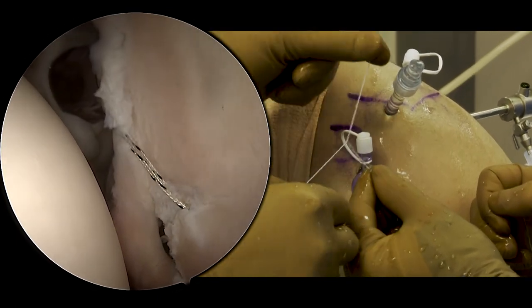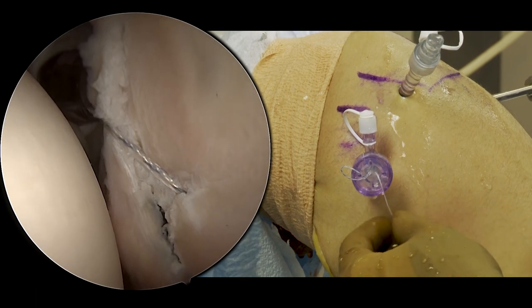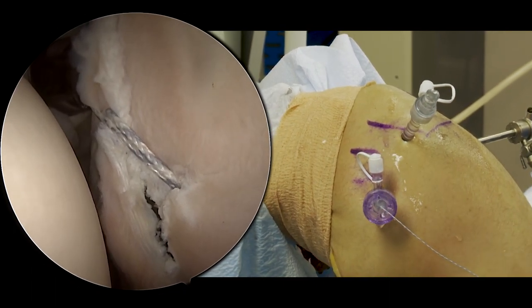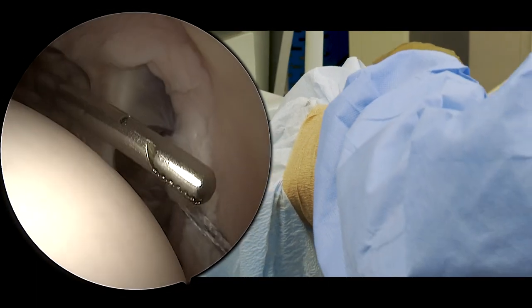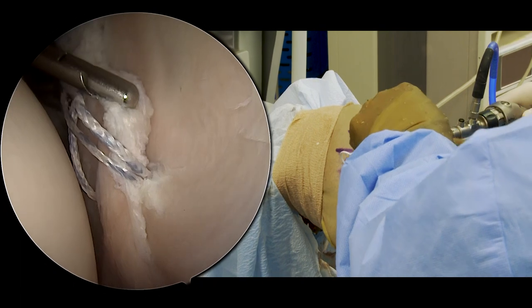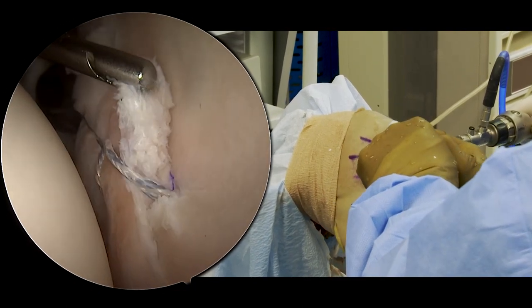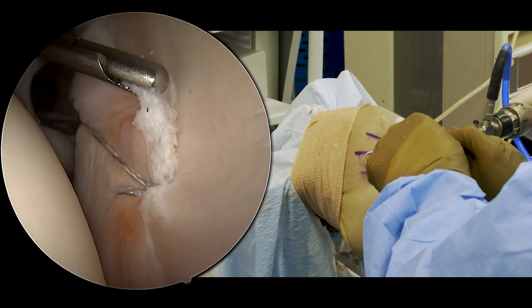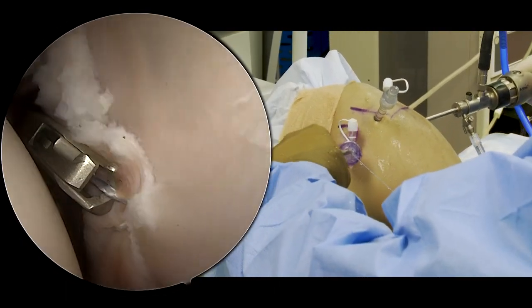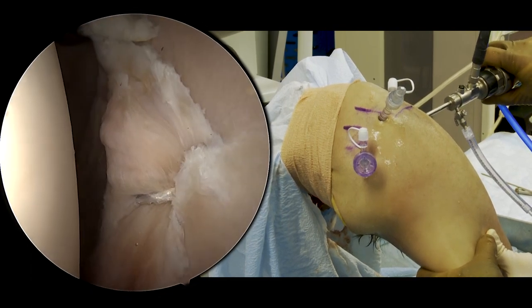We'll fold that over and hold it, get it going, and pop it through. Then we can tighten this up and watch to make sure we don't have any twists in it on the inside. I can come in with my grasper and get a little bit additional shift by pulling up on the tissue here — a real nice pearl to pull up on the tissue prior to securing it down. You can get an additional few millimeters or even a centimeter of shift from inferior to superior. We'll cut it right at the cartilage. And that's our first anchor.